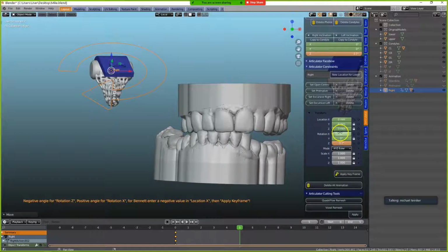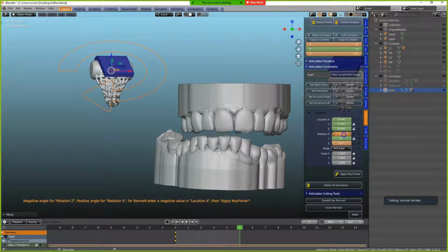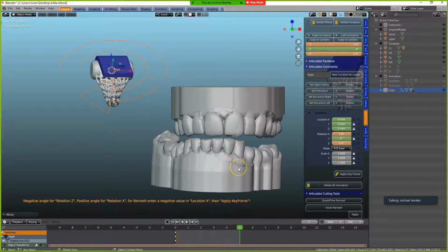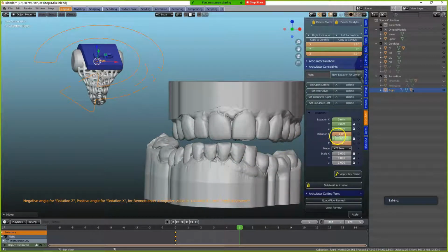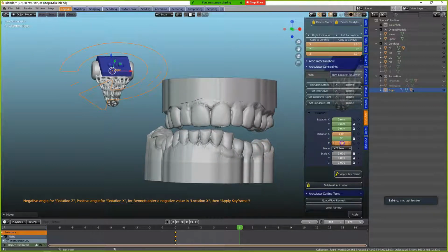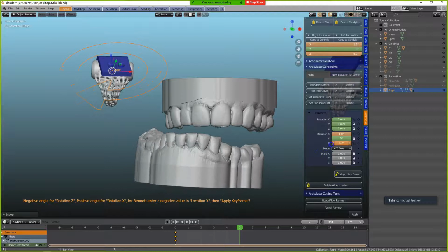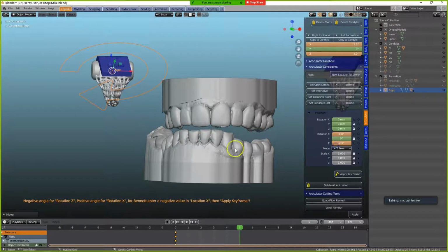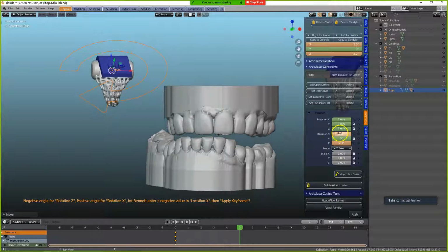So what we can do is open this a little bit just to make sure that we've got enough space for the splint layer. Okay, and so this is 1.8 and 2 minus 3. So this one goes across, and this one opens it up. So we're going to go across, and we've opened it up, just say 2. Okay, and then we're going to apply this.